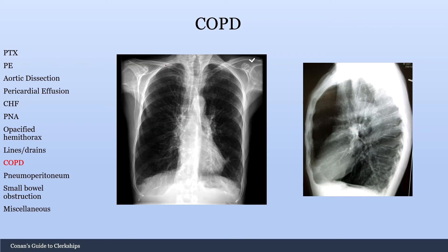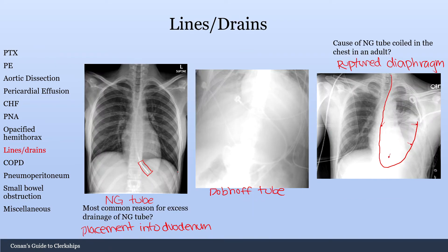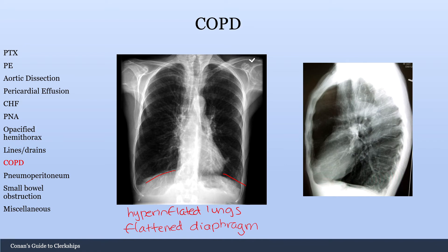Moving on to COPD. There are a couple of findings here that will be important. The first thing to notice is look how hyperinflated this person's lungs are — that is one of the hallmark signs of COPD. Another thing you should be looking at is the diaphragm. This is what's called a flattened diaphragm. Compare this to a normal diaphragm — look how curvy this diaphragm is, whereas this person's diaphragm is just so flat, both on the lateral and the frontal x-ray.